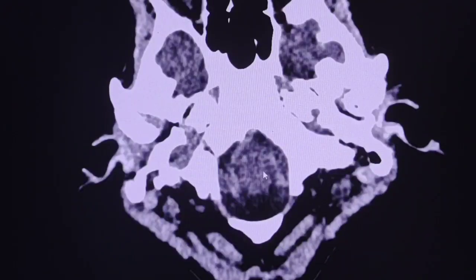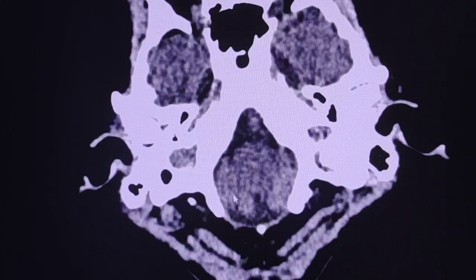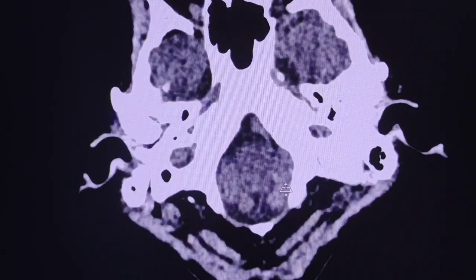This is the medulla oblongata and here normally are the cerebellar tonsils. They are lying a little lower than expected.